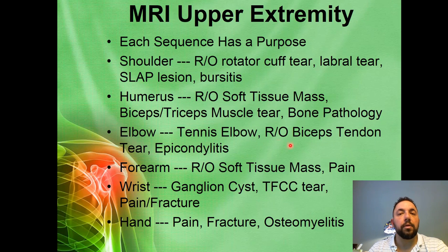In MR, a patient that presents with a prescription for biceps tendon dictates an additional set of instructions that we're to follow. So again, there's a lot of critical thinking in the daily applications of MR. Epicondylitis. So all these different indications. Forearm, same as humerus, same as femur, tib fib. Usually it's just for generic pain, bony pathology, or some form of a soft tissue mass.